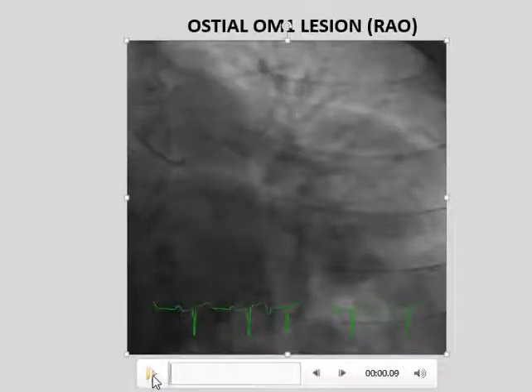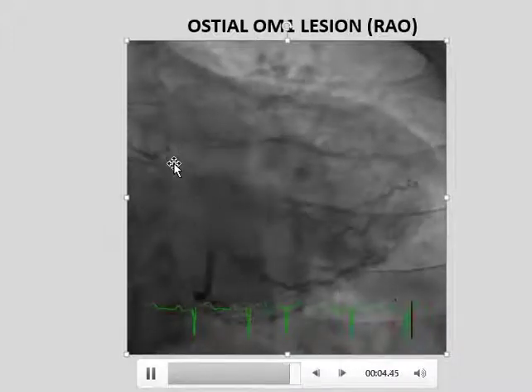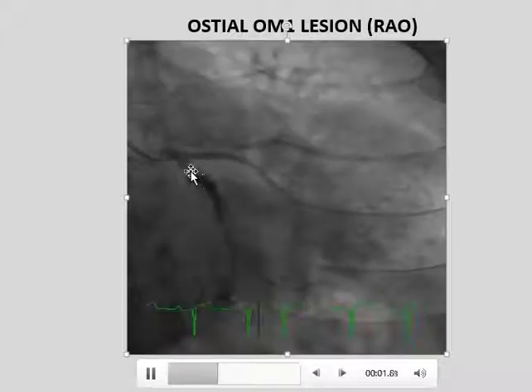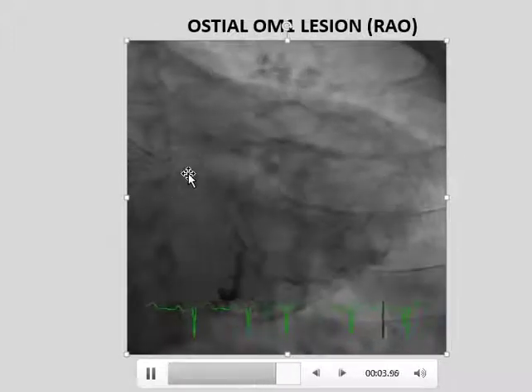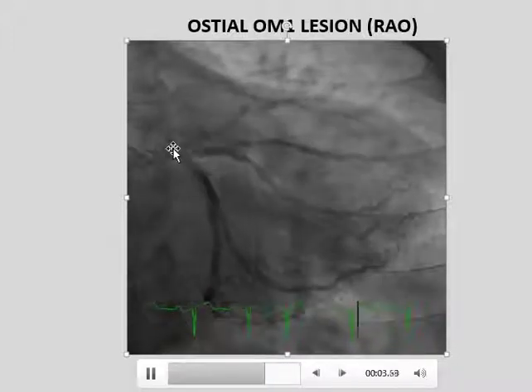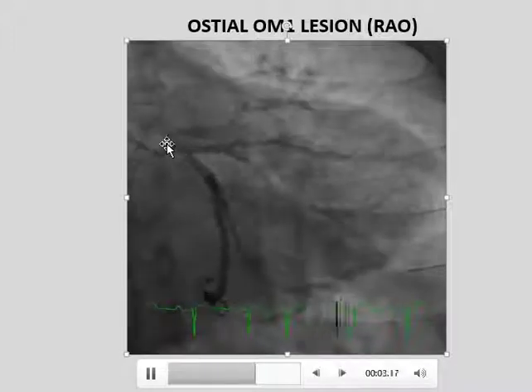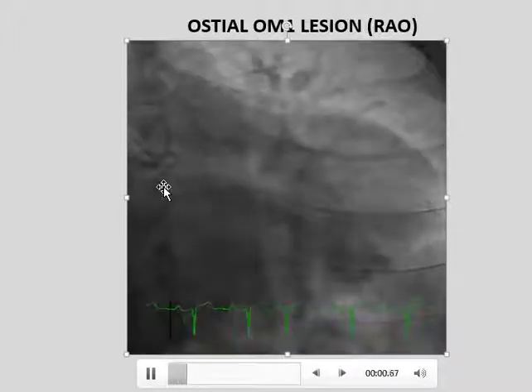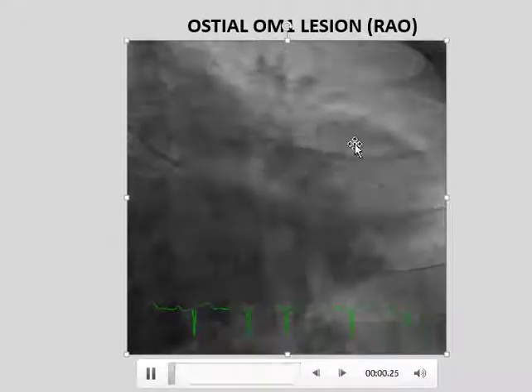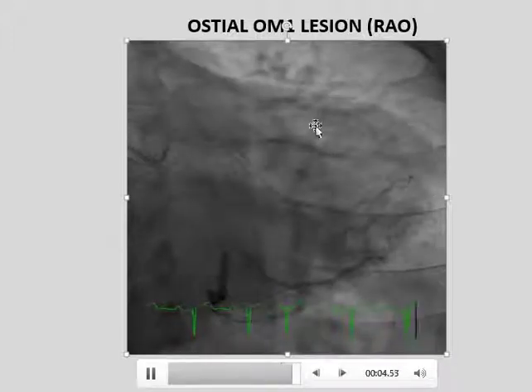We'll move on to coronary disease now. This is a coronary artery injection showing you how the origins of the left circumflex and the left anterior descending are almost separate. There's a very, very short stump of a left main. Sometimes they are completely separate origins and we have to inject them independently. The width of the left coronary artery indicates it's likely to be normal, but we would have to do a more selective injection of that to be sure.